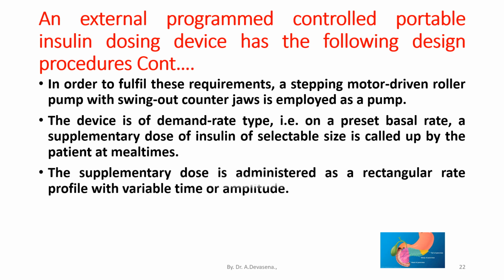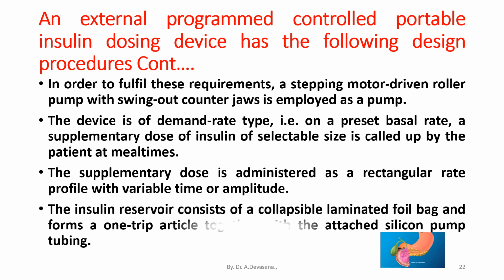The supplementary dose is administered as a rectangular rate profile with variable time or amplitude. The insulin reservoir consists of a collapsible laminated foil bag and forms a one-trip article together with the attached silicone pump tubing.